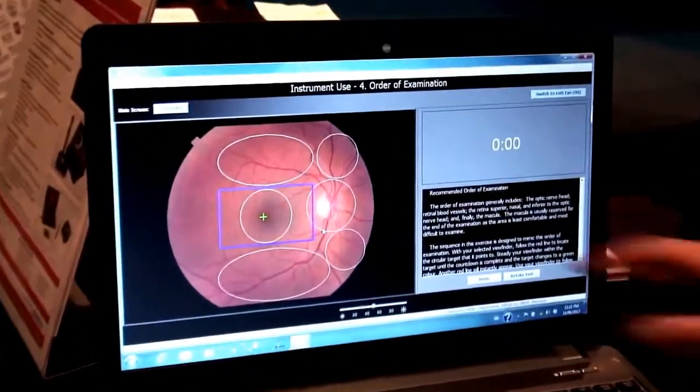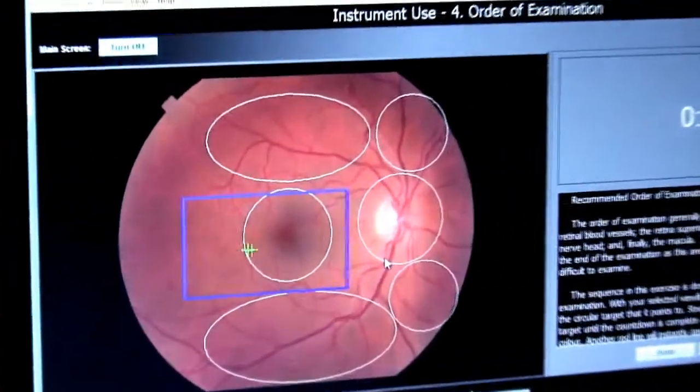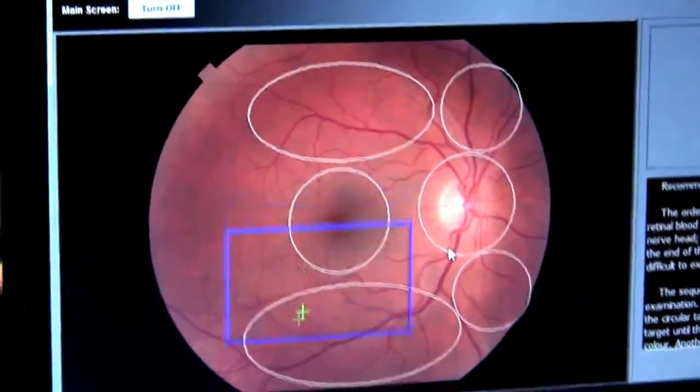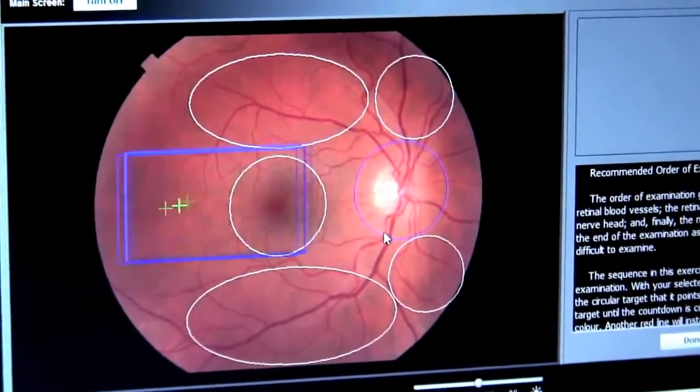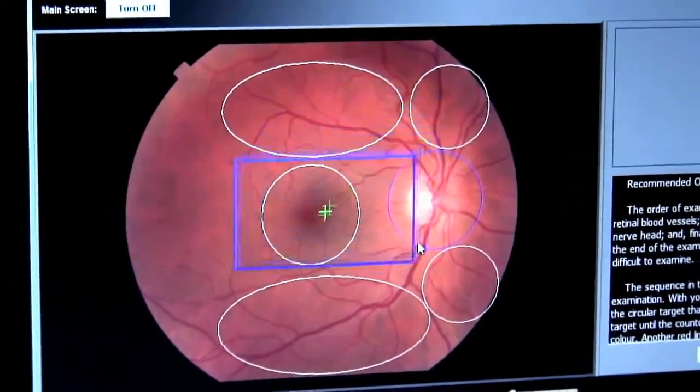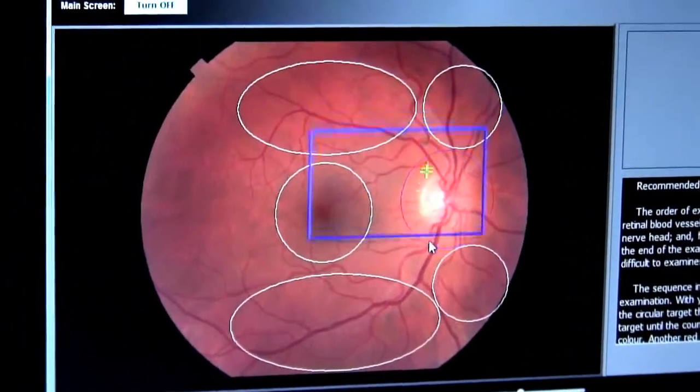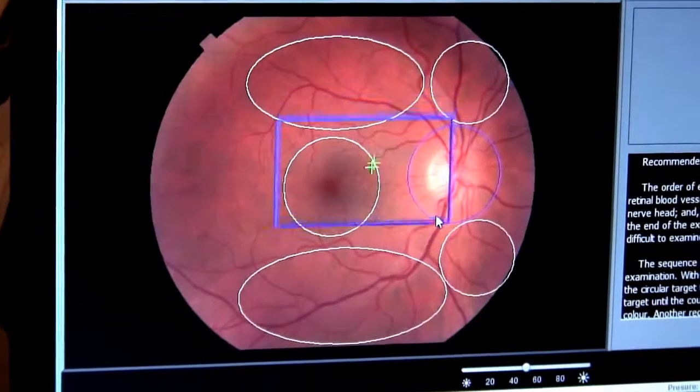So for example, this blue square here is the field of view for the student. As a student navigates and looks around the eye, the movements are tracked and are actually seen within the Opthosim unit.